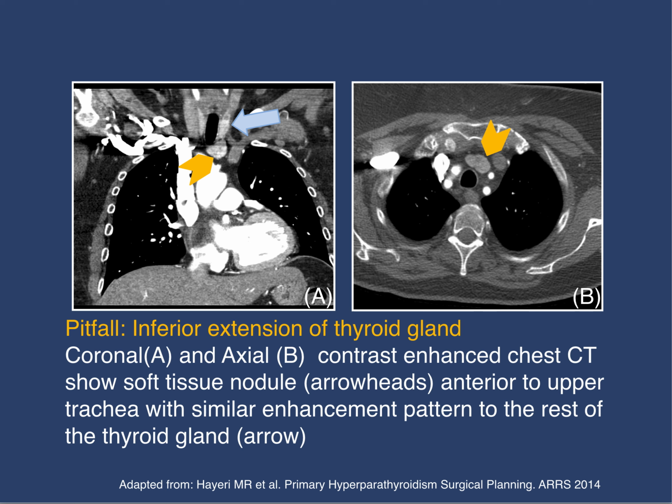The biggest challenge for localizing parathyroid adenomas, if we see something, tends to be ectopic thyroid tissue in the mediastinum, and sometimes we can have a separate mediastinal goiter, and it takes some experience and some effort in telling this apart from parathyroid adenomas. One modality that I do find helpful for that is actually non-contrast CT, because thyroid tissue is normally bright, whereas a parathyroid adenoma is not going to be bright because it does not have iodine, so that can make all the difference in the world.